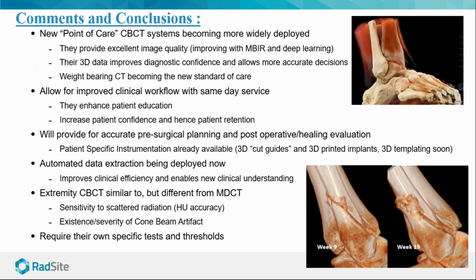So just to finish up, these new point-of-care systems are becoming widely deployed in areas that are very different than the traditional radiology departments, out into dental offices and orthopedic practices that historically haven't had that much experience with 3D imaging.